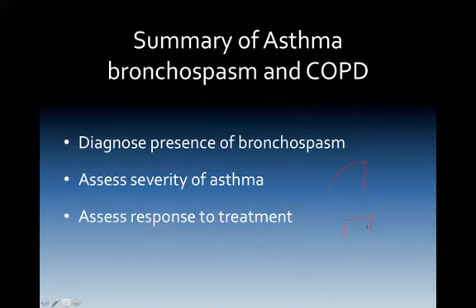Now, what we should see in asthmatic treatment is at first we may have very small, tiny shark fins, low amounts of CO2, and that's because they're under bronchospasm. They're still trapping air. We cannot see the full gas sample, but once we start opening them up, we will see an increased rise in gas sample, and that is until we correct the respiratory acidosis that they're currently in.